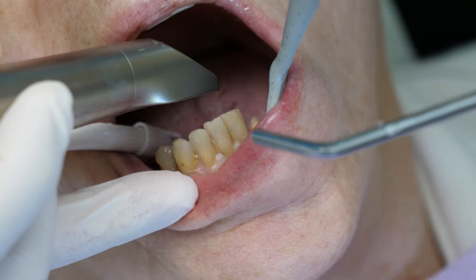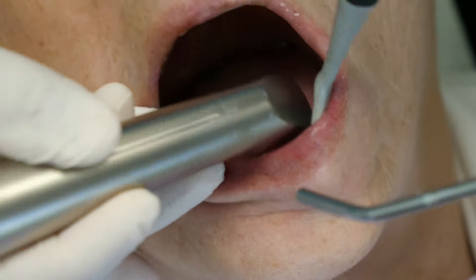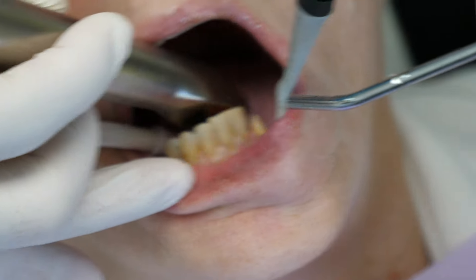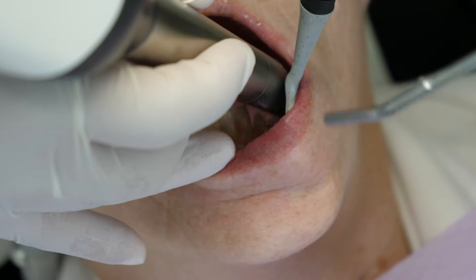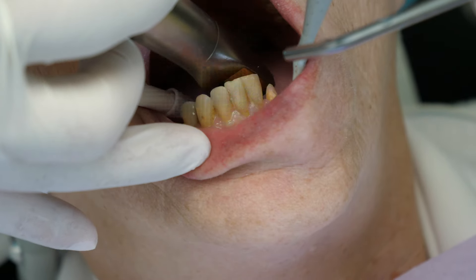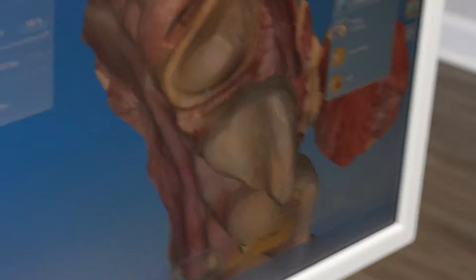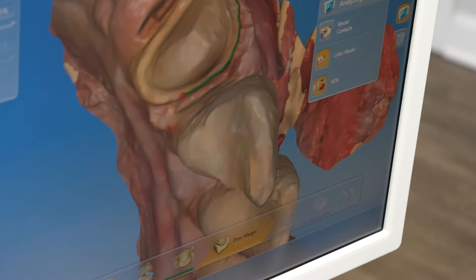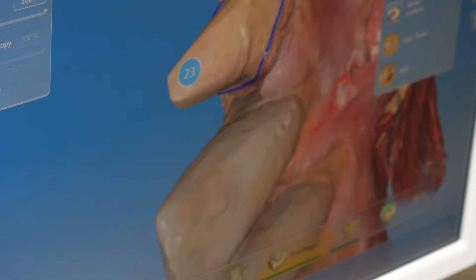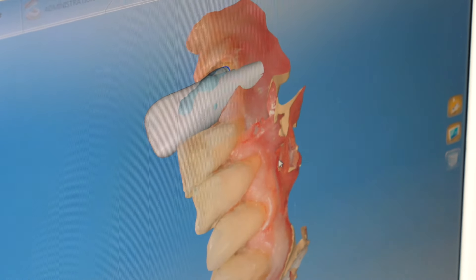Now they will take another impression of the prepped tooth. For some patients, this might be the first impression they are taking. In this video, we did take that initial impression due to the partial denture so we can make an identical crown dimension to fit. Either way, here we are taking another digital impression. Next, they will design the crown — in this case, also copying the same dimensions of the side of the tooth that the partial denture connects to.